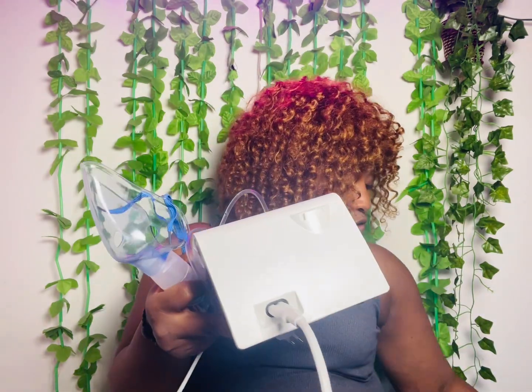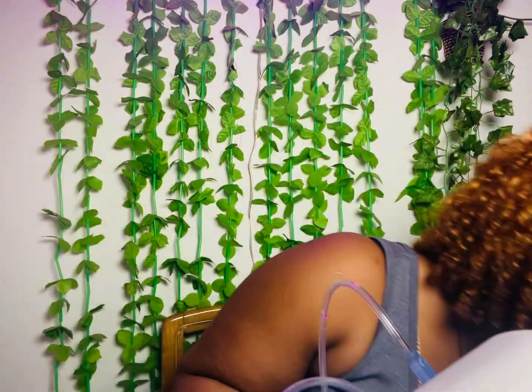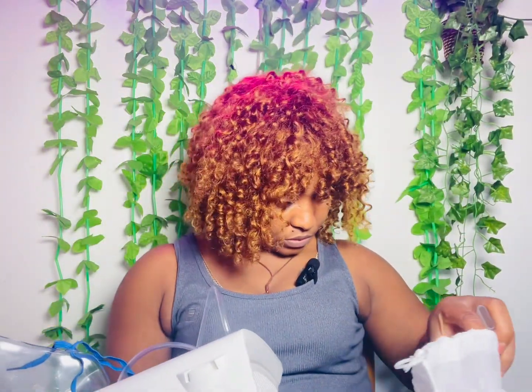I don't know if I'm missing something. No, I don't think so. But sorry, I have to go down to check. Okay, aside from that, I think we still have the ones for mouth. We have these two, one for adult, one for kids. So either you use it via your nose like this, or you use the one for the mouth. So we have adults and kids.